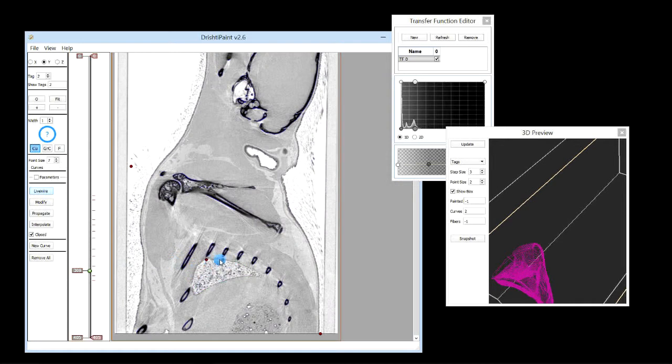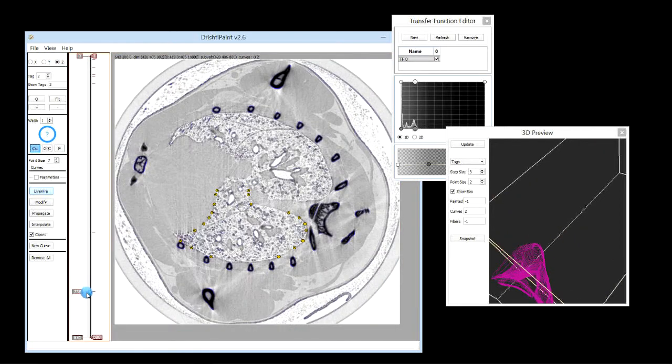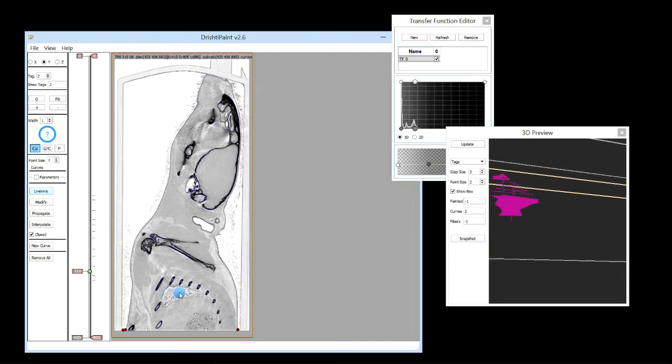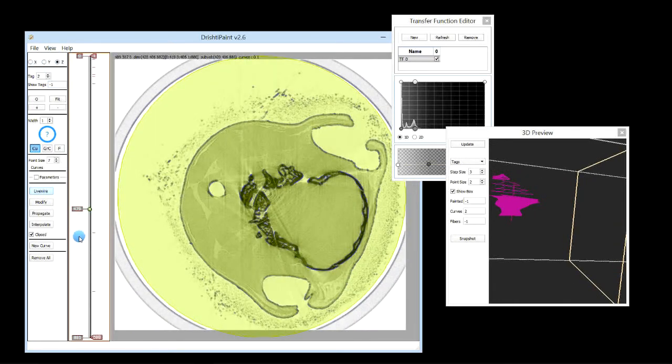The dots you see here are the two curves that are in the z-axis. There's only one curve here, so this is the curve that we see, which is this one here, and the other curve is from a different axis, a different tag. So let me just show you. Minus 1 to show all the tags. So it's these curves here.